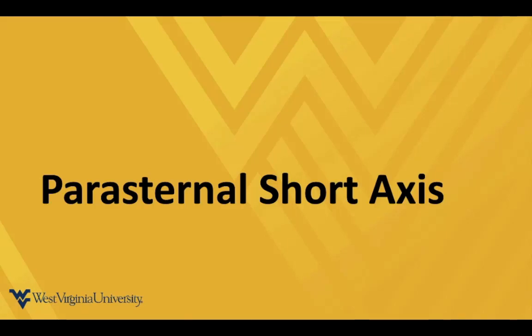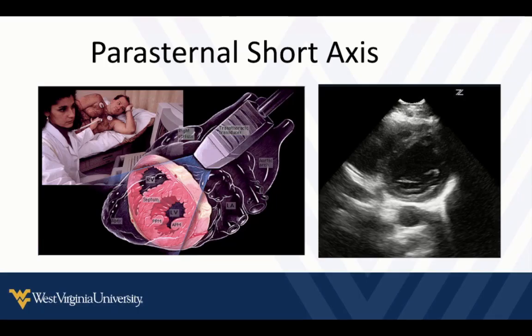Once we get that view we're going to move to the parasternal short axis. The probe is in the same position on the chest, but we want to identify our parasternal long axis view and then rotate the indicator to about one o'clock, so about 90 degrees clockwise, to identify short axis views of the heart. We're getting cross sections focused on the left ventricle, but we'll see other structures as well.